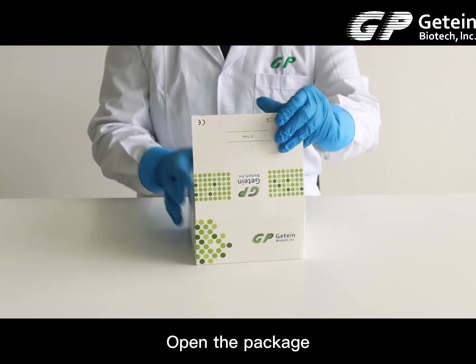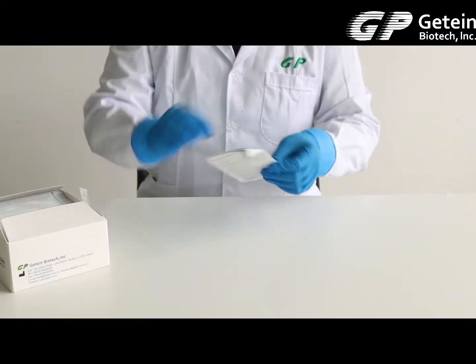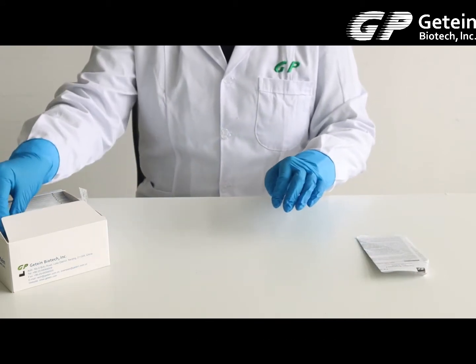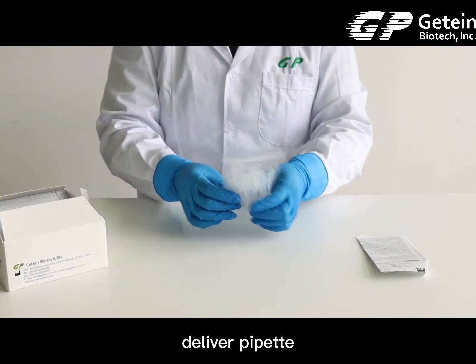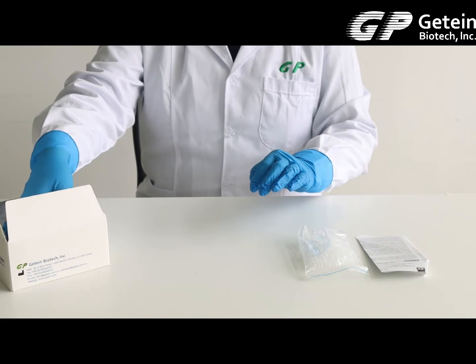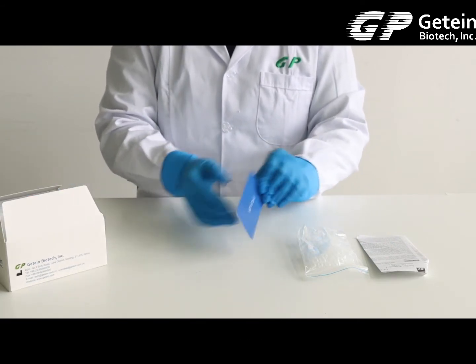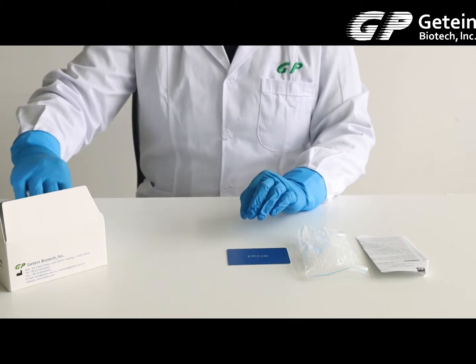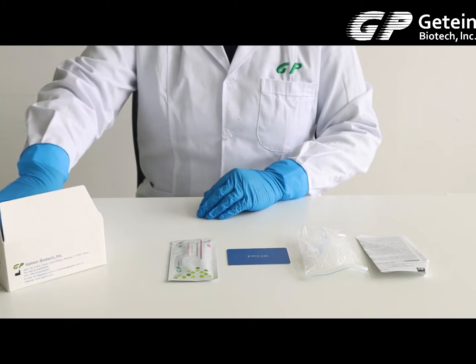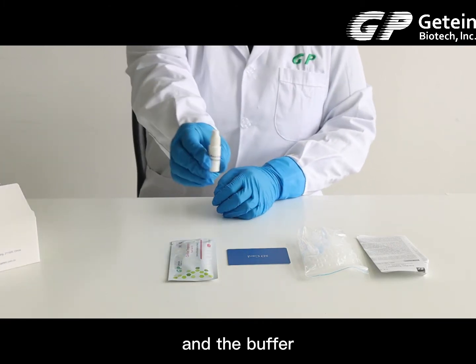Open the package. You'll find the user manual, delivery pipette, SD card, test kit, and the buffer.